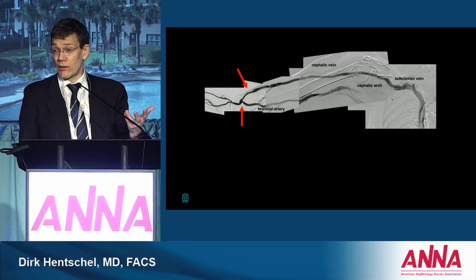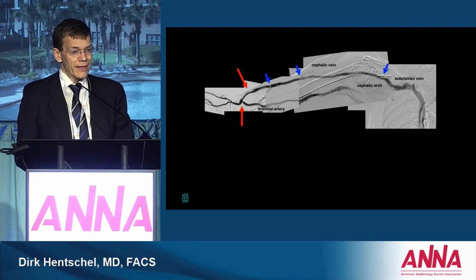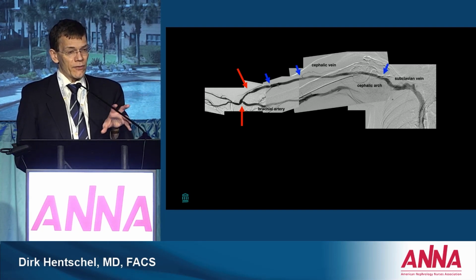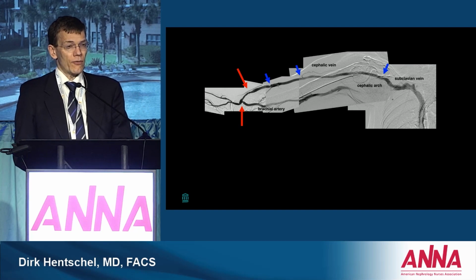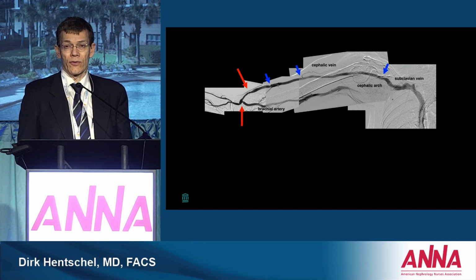and you can see here there's some inflow narrowing, which is very typical for this type of stenosis in the presence of surgery, moving the vessel around. There's often a little squishiness. In addition, you have these valves, and then towards the shoulder, you often have a cephalic arch stenosis, which is a preformed site of stenosis in an upper arm brachiocephalic vein because you get turbulent flow along the cephalic arch, and that leads to vein injury and endothelial proliferation.